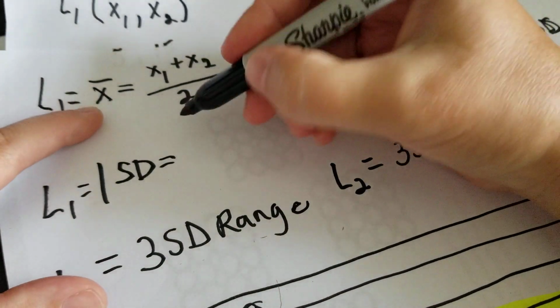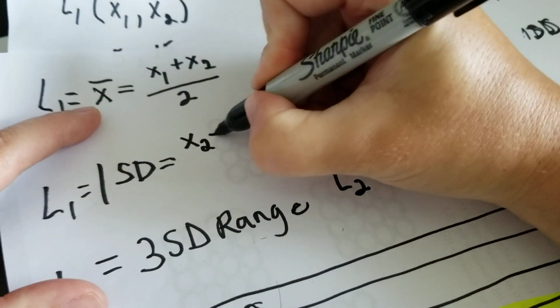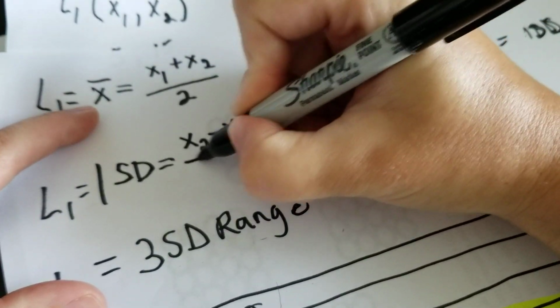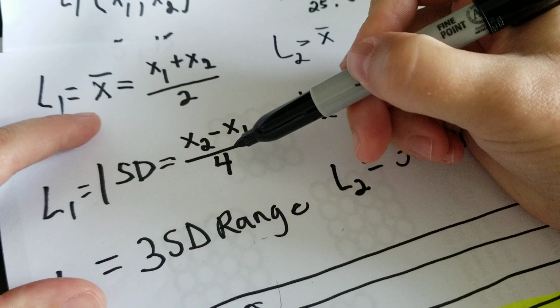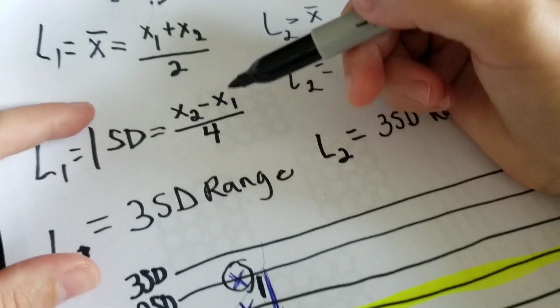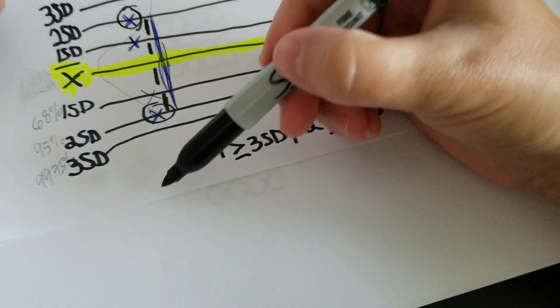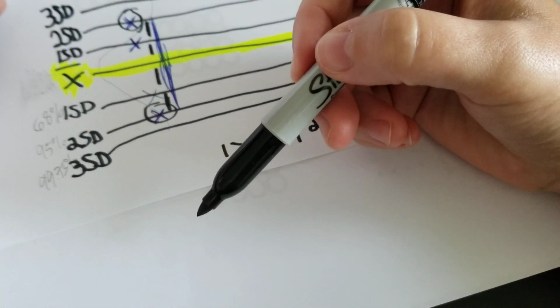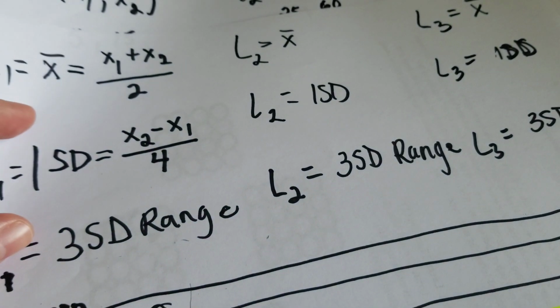So knowing that, what we can do is take X2 minus X1 over 4, because remember, there's 4 spaces. And if we did this the opposite way and we did X1 minus X2, that would take us well below this 3 SD range, and that's why the equation is not that way.